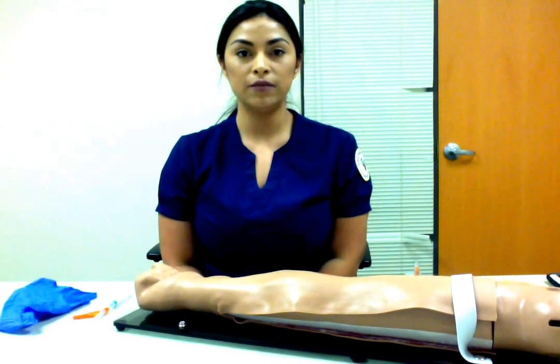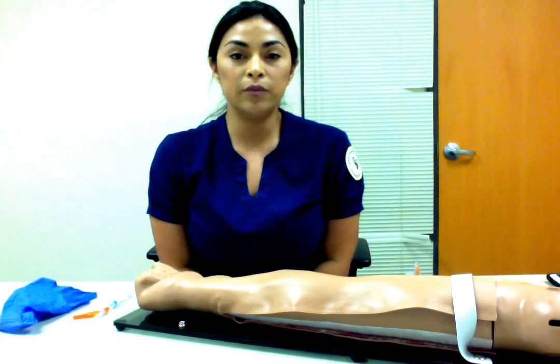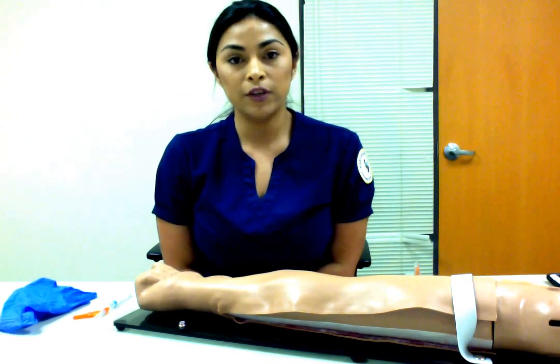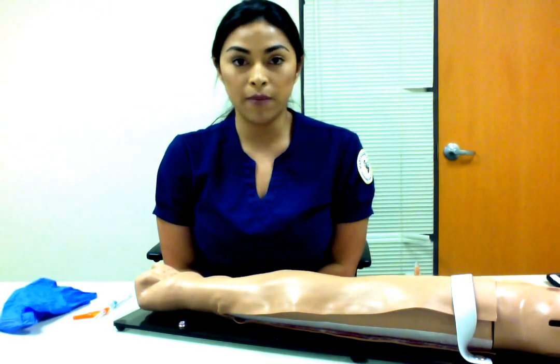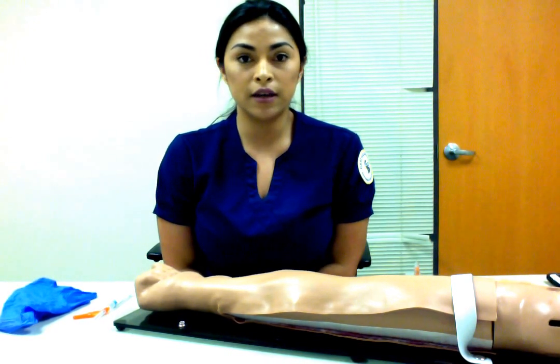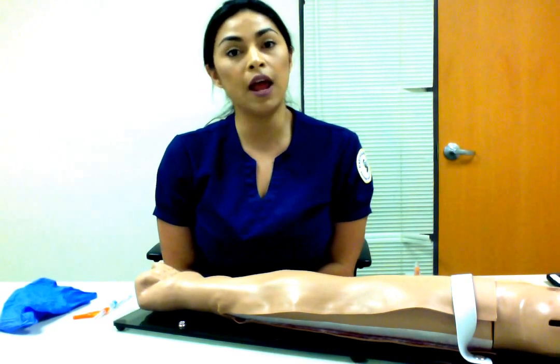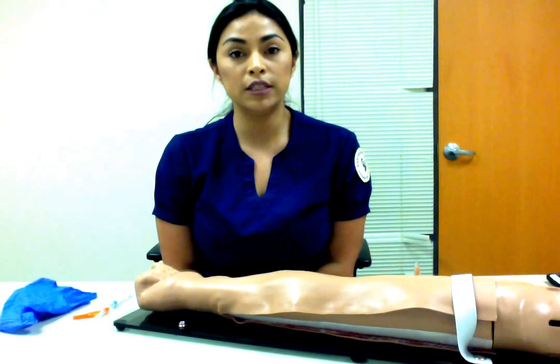Some other indications for obtaining a blood gas sample would be cyanosis or shortness of breath, or if you're trying to diagnose a respiratory problem. Some contraindications would be if the patient is on any anticoagulants, or if the patient has any arterial shunts or grafts.